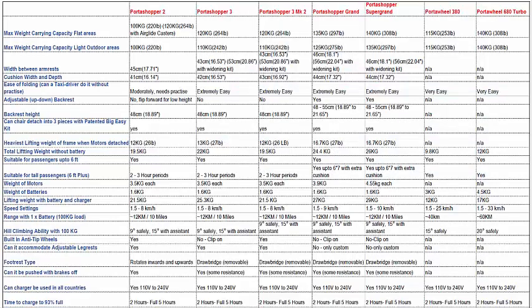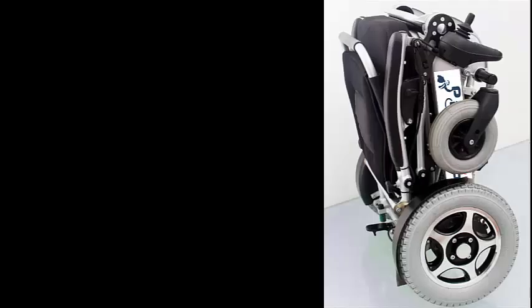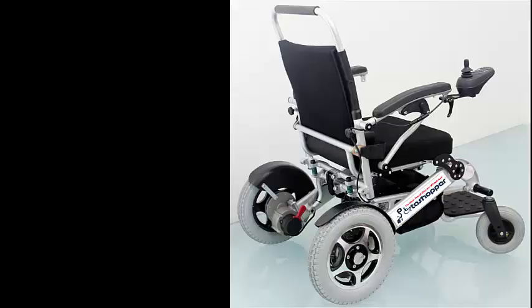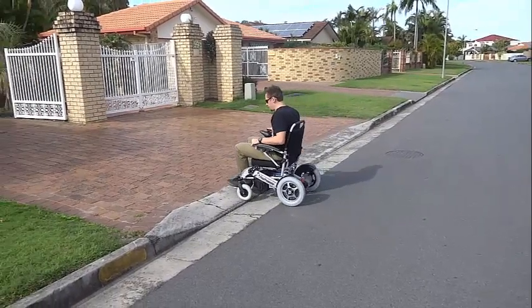Finally we move to the PortaShopper Super Grand, the last and most heavy duty of the PortaShopper wheelchairs, before moving on to the PortaWheel Power Assist units. The wheel diameter of this unit is a massive 33cm or 13 inches, and this larger pneumatic wheel size allows for a very smooth ride with great outdoor performance.